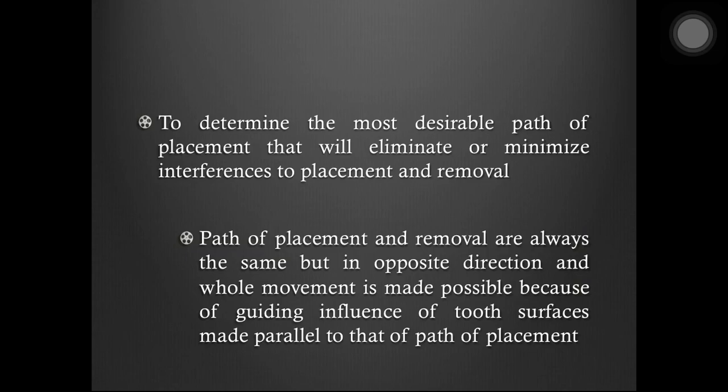The denture should not move in any direction other than the path of placement and removal, because this requires the ability of a denture to retain its place, or to have adequate retention.